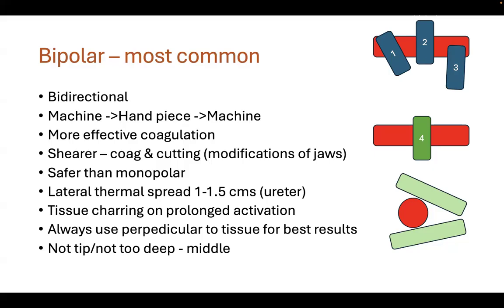But if you use a bipolar cautery on a tissue for a long period of time, there is a phenomenon called charring which happens. So I'll explain charring, why it happens, because when you apply bipolar, if you can see this diagram, I've put a few diagrams here. If you notice the diagram down without the numbering.